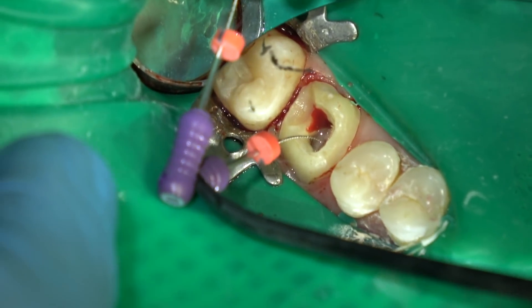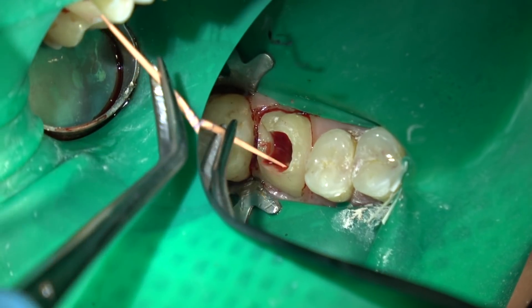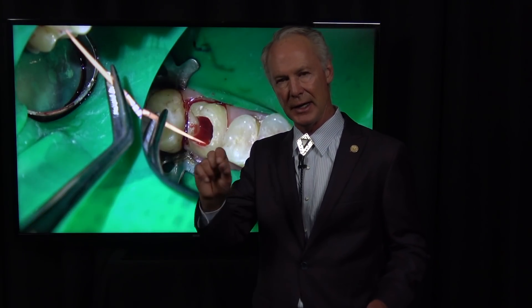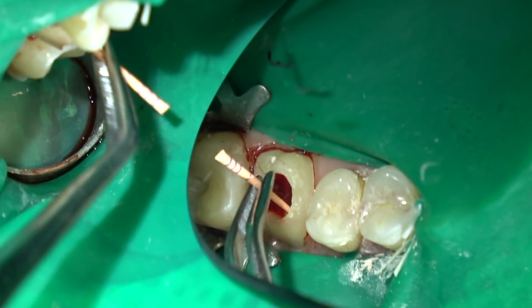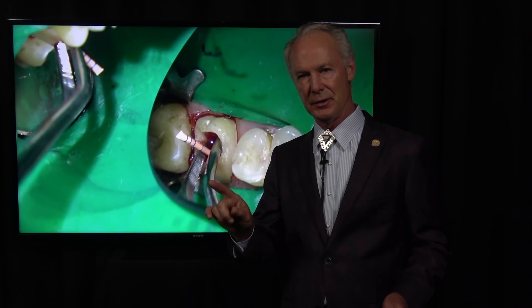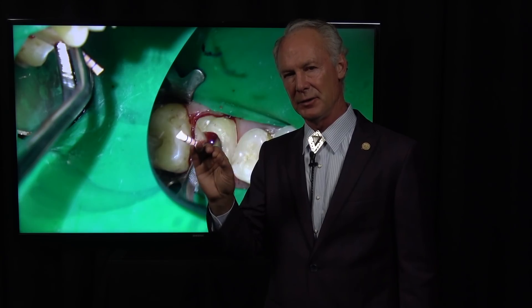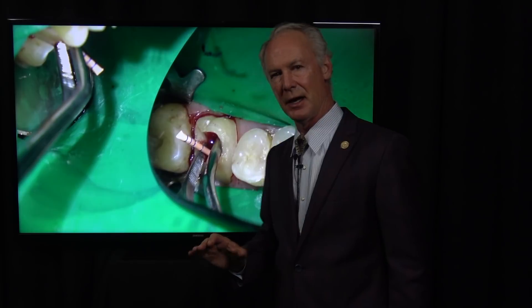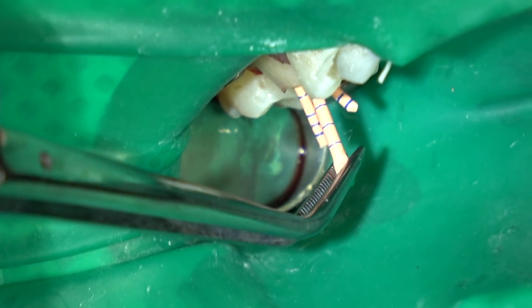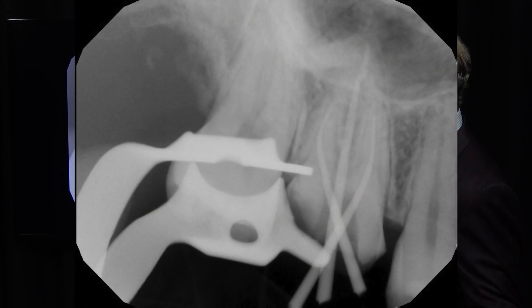Here's the MB2 canal — sometimes you can get it and sometimes you can't. I try to clean it out if I can. Now once you've used the EJO2 drill, the nice thing about it is you use a 30 gutta-percha cone 99% of the time — sometimes you have to drop down to a 25, but 9 out of 10 times it's a 30 gutta-percha cone. Pull three 30 gutta-percha cones, place them in the canals, take a periapical radiograph.